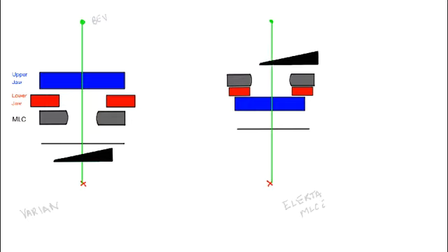The other one is up here in the head of the machine, and it can move in and out. So because it's not accessible outside the room, there has to be some electromechanical system to move it in and out when you need it and don't need it. Also, because of space constraints, there's only one physical type of wedge in this system. It's the 60 degree wedge. And to get different angles, you use combinations of open plus wedge beams to get the angle that you need.